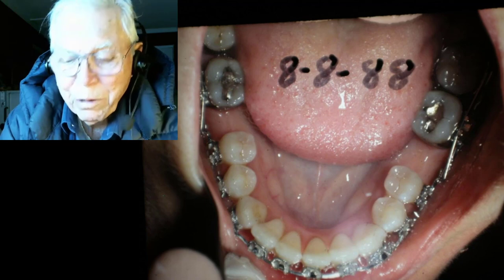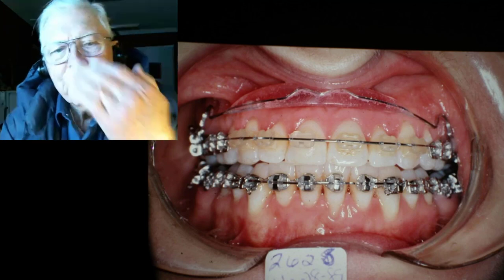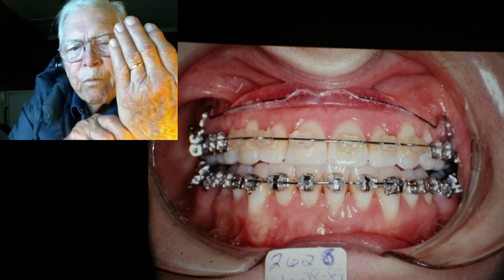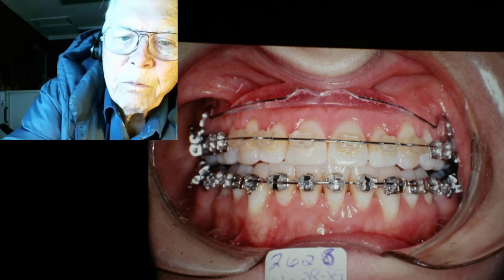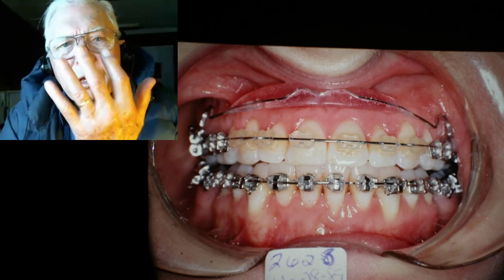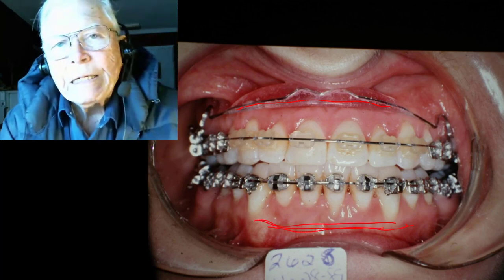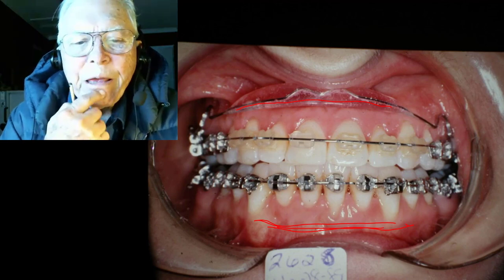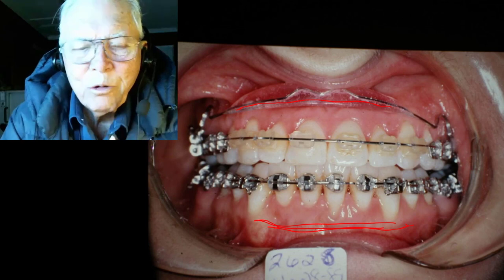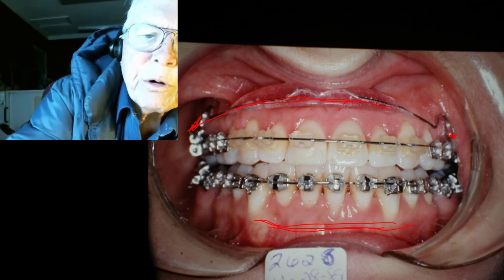She's put on a few pounds at this point, but you can see how it changed her appearance. Here we put in the upper lip bumper — I want to move the upper teeth forward but I don't want to just tip the crowns. I want to move the whole tooth — roots and all — outward. To move the roots out, you've got to take the pressure off the lip. That's especially true when somebody has a tight lip pulling back against the teeth you're trying to push forward.